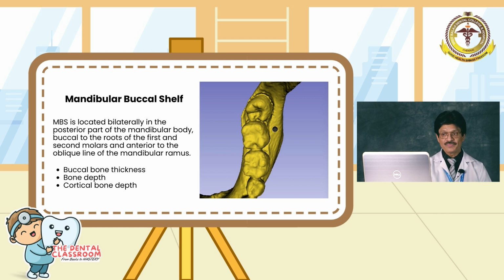Mandibular buccal shelf is located bilaterally in the posterior part of the mandibular body, buccal to the roots of the first and second molars and anterior to the oblique line of the mandibular ramus. Why here? You are going to bypass the roots of all the mandibular molars. There is good buccal bone thickness here, good bone depth and good cortical bone depth.